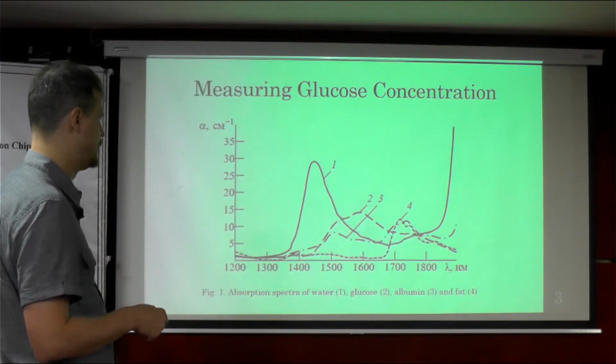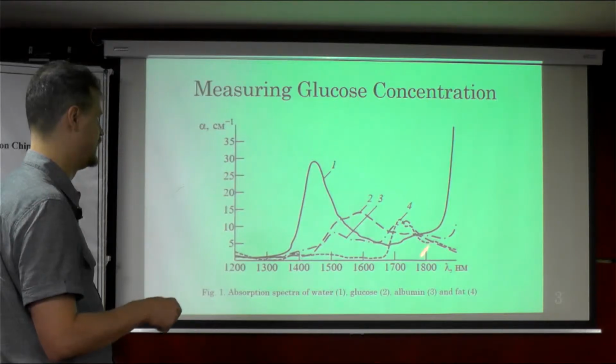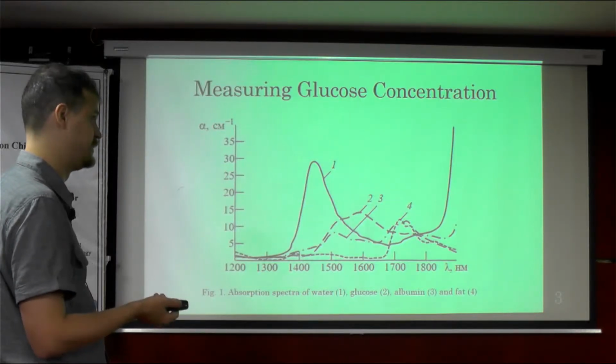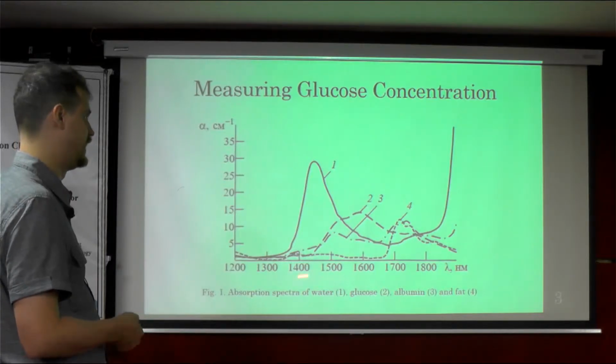The main idea is to choose the parameters of the glucose sensor operation that will not be interfered with by any other metabolites, substrates, or solutes, or solutions in that case, if we talk about water, because the main type of solution in blood is actually water.